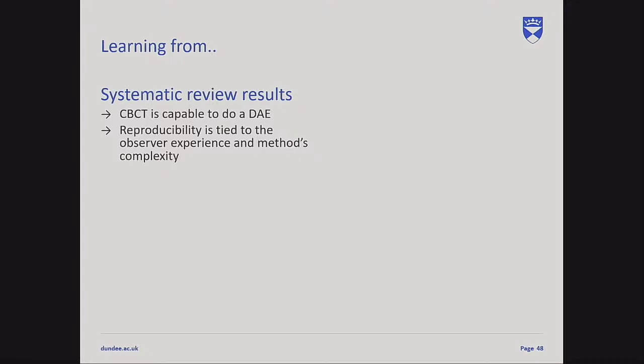So from the systematic review, we can see that CBCT can do dental age estimation nicely. And reproducibility is tied to observer experience and method complexity. Those two are not separated.